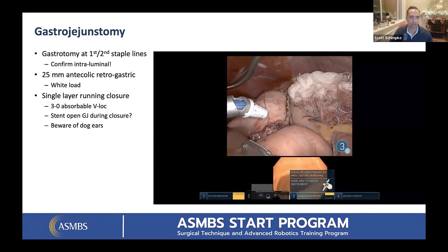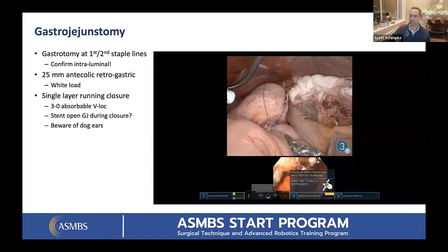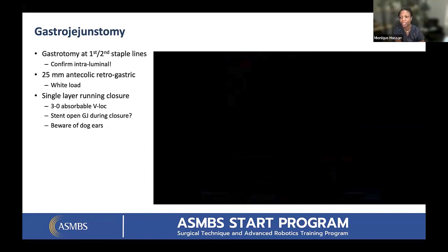Does everyone else do a leak test of some kind? Obviously, there's ICG and other ways to do it as well. Yeah, I use ICG, but I use the stapler as the bowel clamp as well. I'll clamp it right at that corner, because I'm coming from arm one, and then slip it right underneath. The other thing I do, for efficiency's sake, is close Peterson's before I even transect the Roux, so I don't have to come back. I test it there, close Peterson's, then transect, because I don't want another staple or instrument exchange. Gotcha. That is a good idea. I like that.